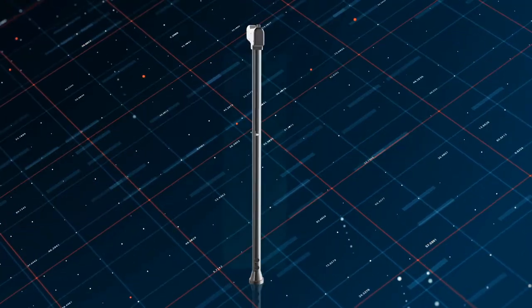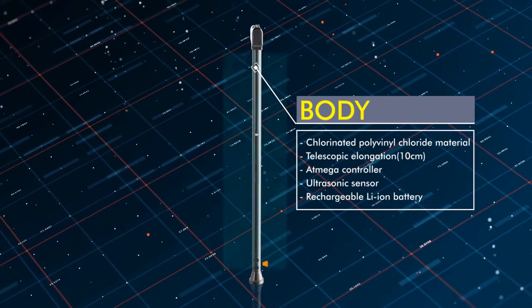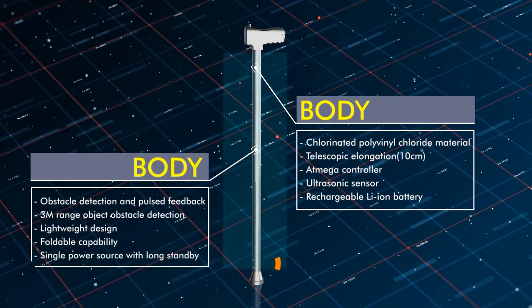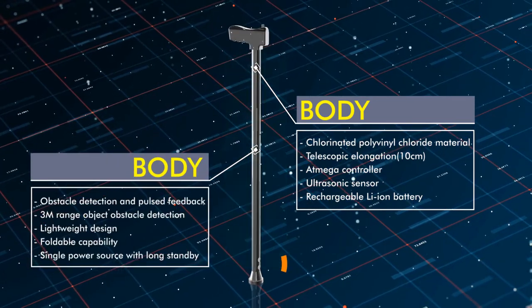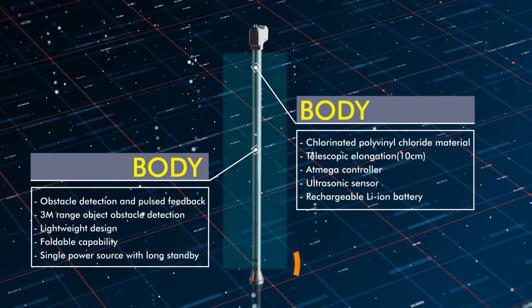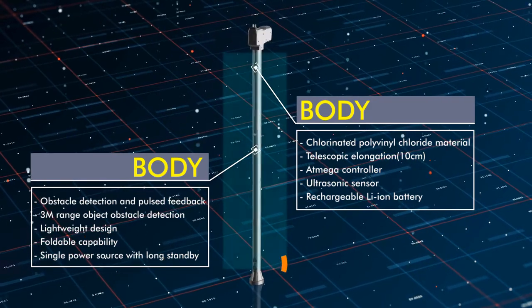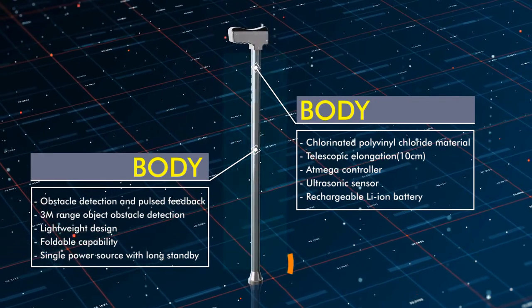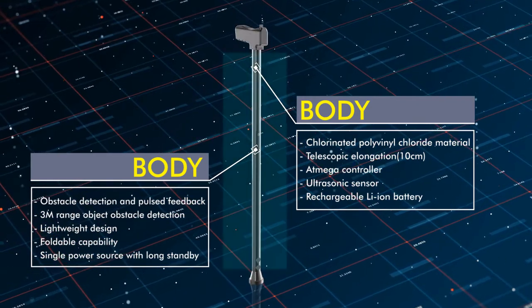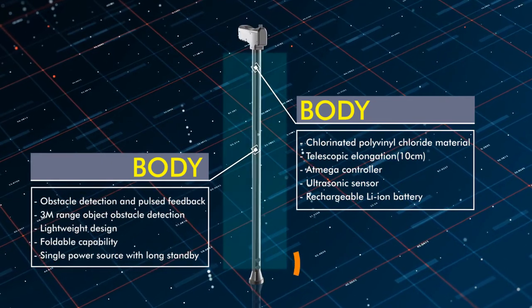Moving forward with the body design — the body is made up of CPVC material, which is widely available in the market. I considered different parameters while choosing CPVC, such as operating temperature, load, and density, which make the system lightweight. The body is divided into five different segments of 19 centimeters each, making the walking stick foldable as well as flexible. The total length is around 100 centimeters.